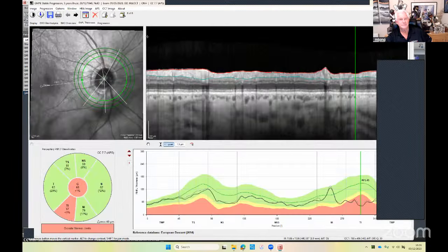All right. Well, we were going to wait all the way to 8. Remember we were at 43, and after 5 years, he's still at 42. So nothing really changed in that location there. So you could say, well, that's great because we immediately put Bruce onto treatment when he first came because we could see that that was an obvious glaucoma defect. You could say that, well, that's great because nothing changed and he's stabilized. You could also say, well, we're not expecting to see any change there. Or you could say, that seems to be quite a reliable progression sequence. I could be confident in my management of my patients.